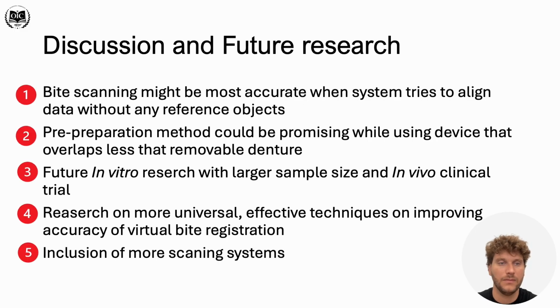And to conclude, bite scanning might be most accurate when the system tries to align data without any reference objects. There is no supplementary geometries involved in the bite registration scanner field.